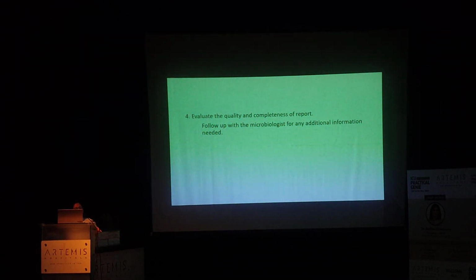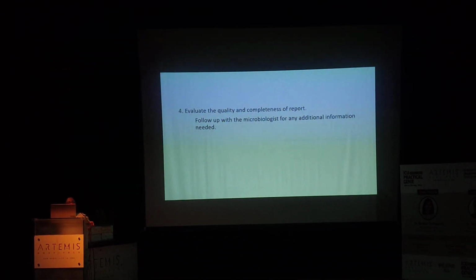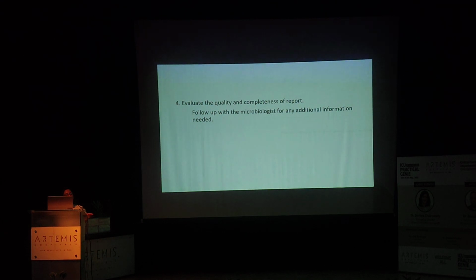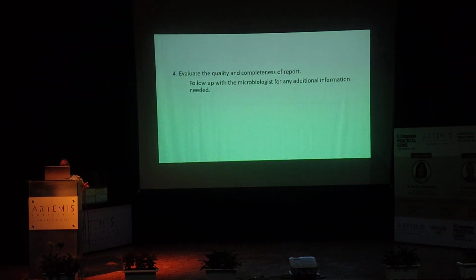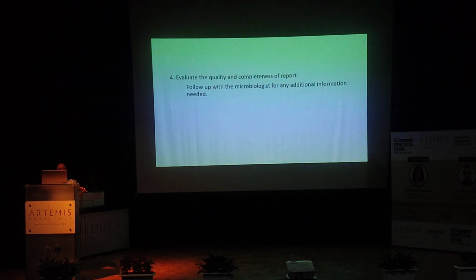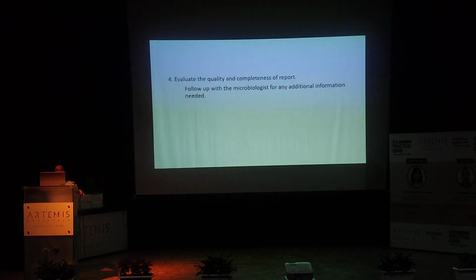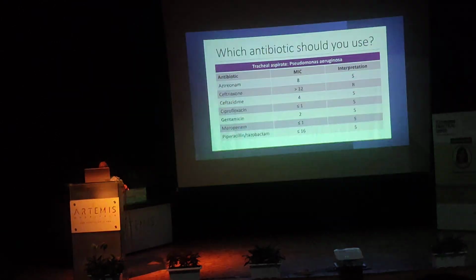Then, last but not least, evaluate the quality and completeness of the report. As I said already, if a sample is contaminated, it will give you false positive results. So follow up with the microbiologist for additional information, because there is always some information which is known to the microbiologist only, and we have to contact the microbiologist if we want some extra sensitivity to be detected.